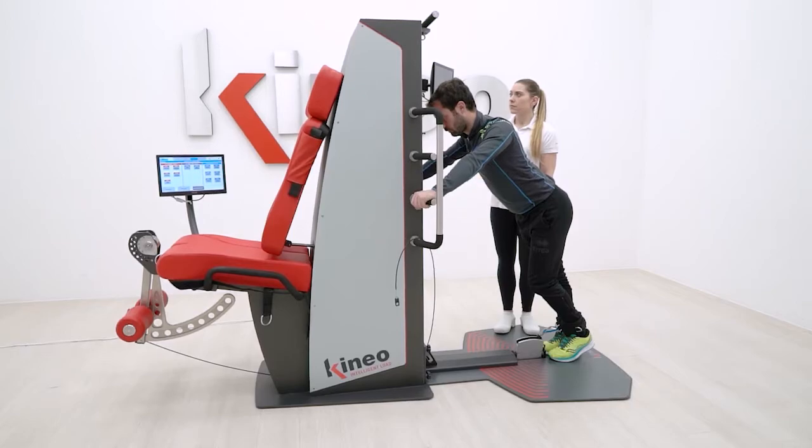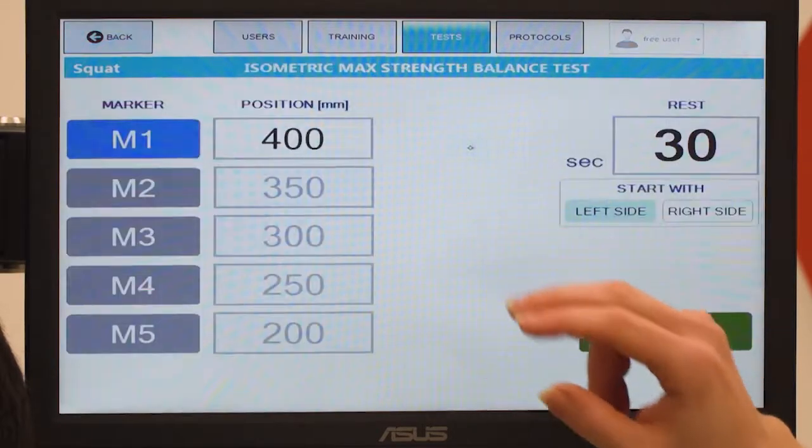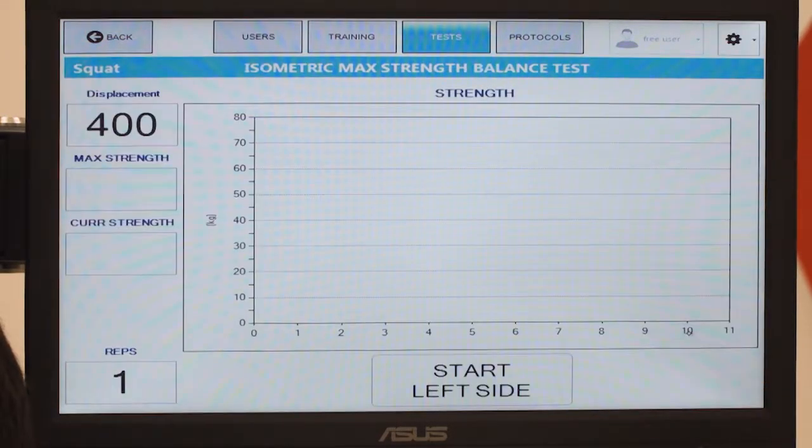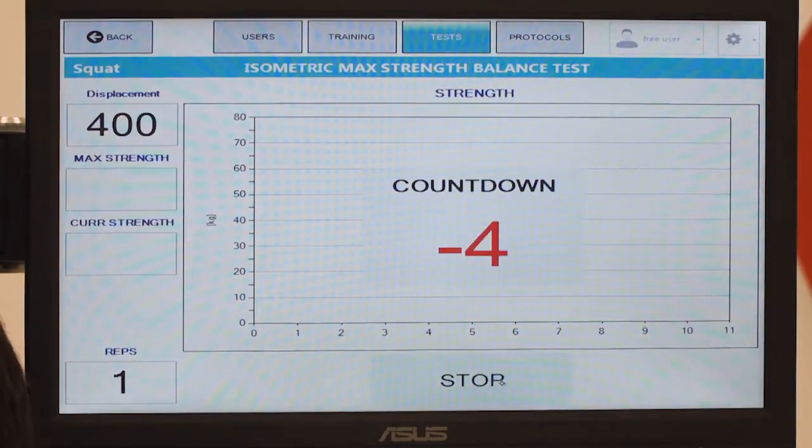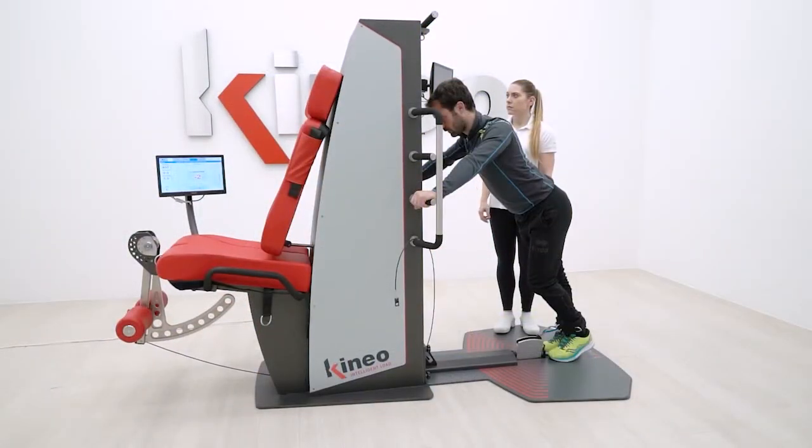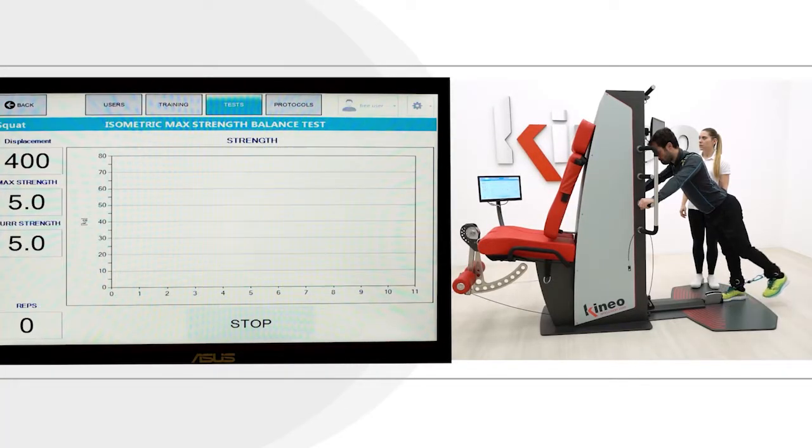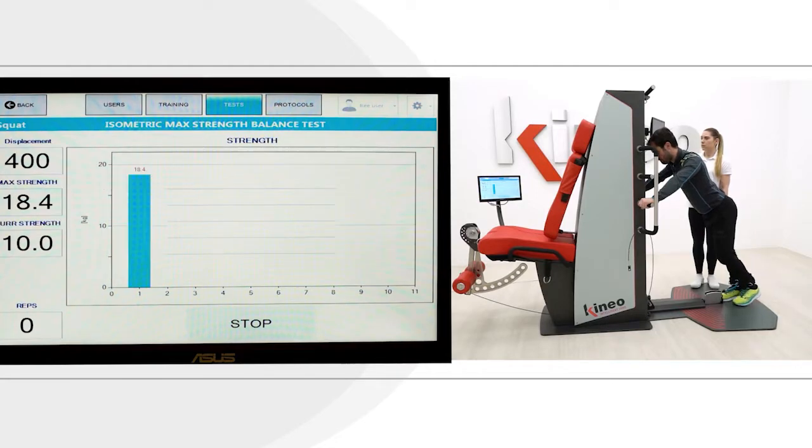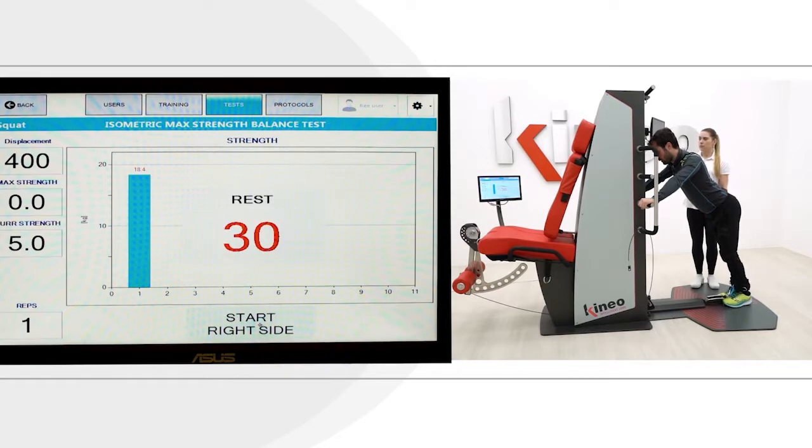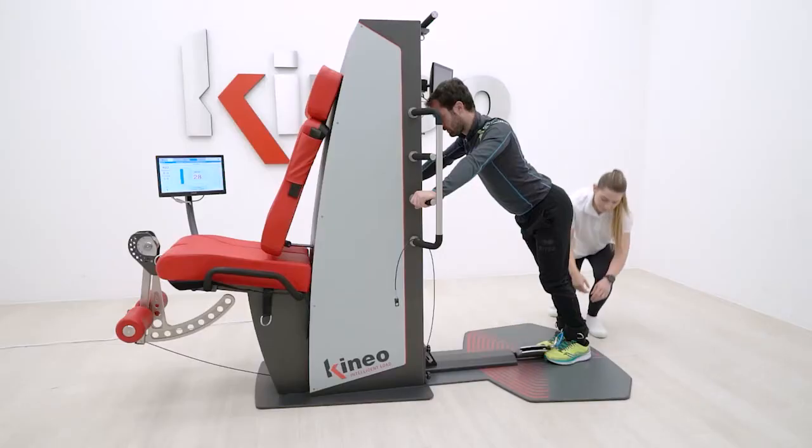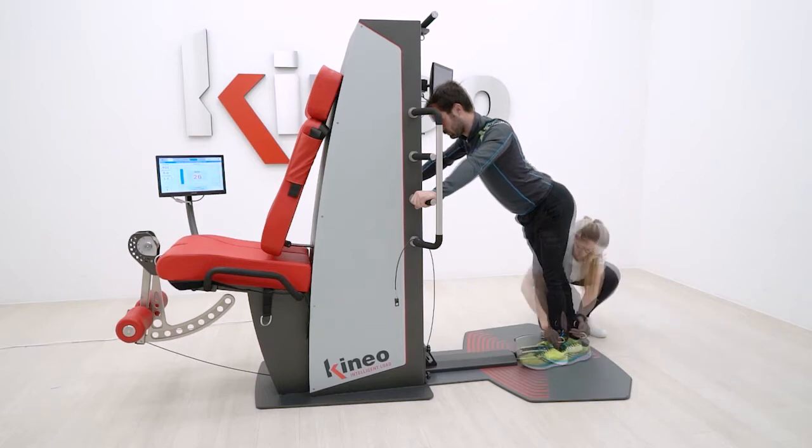The isometric test on Kineo is performed by choosing the isometric max strength balance test while standing on one leg. With the cable attached to the ankle, the option balance will test the non-injured lower limb first and then the other limb during an isometric maximal contraction with the knee completely extended.